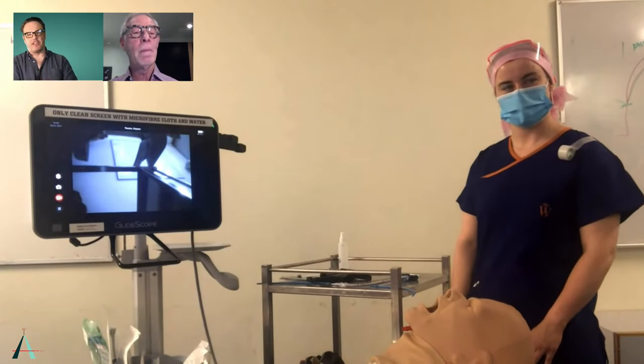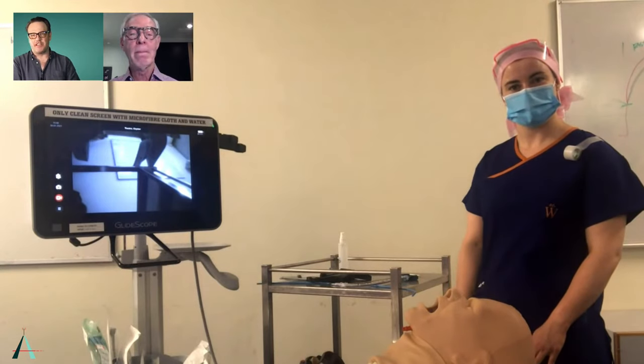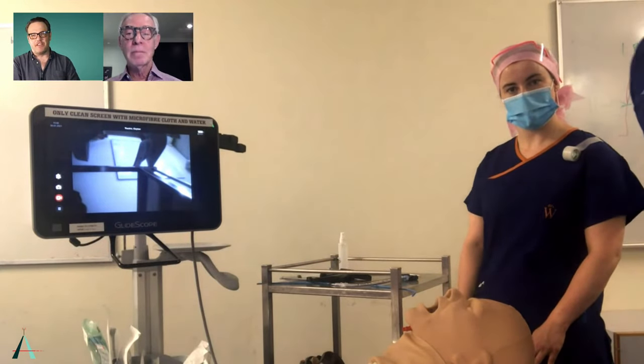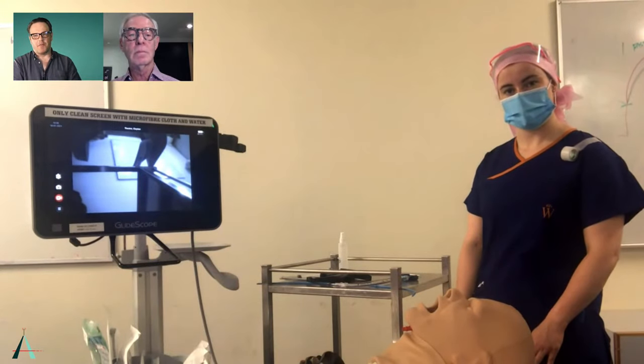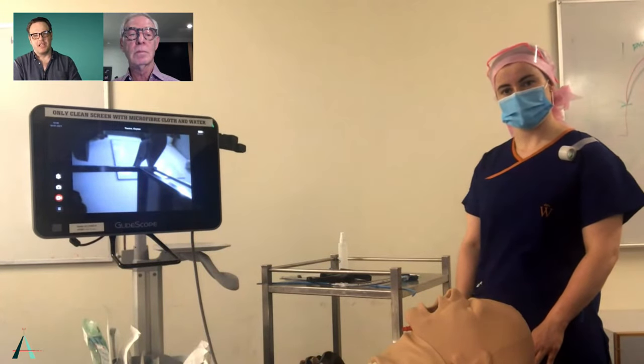With both of these things, I got the assistant in too, Richard, because I think it's important to stress that training for this is not just about training the airway operator, it's about training the whole airway team and making sure the assistant knows what you're doing so that you can work cooperatively when you're doing this.